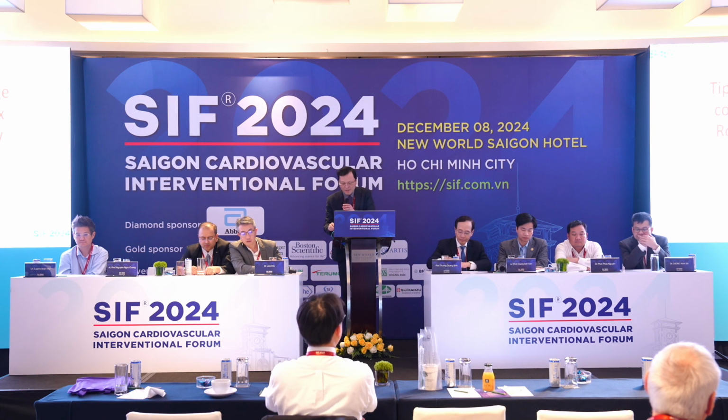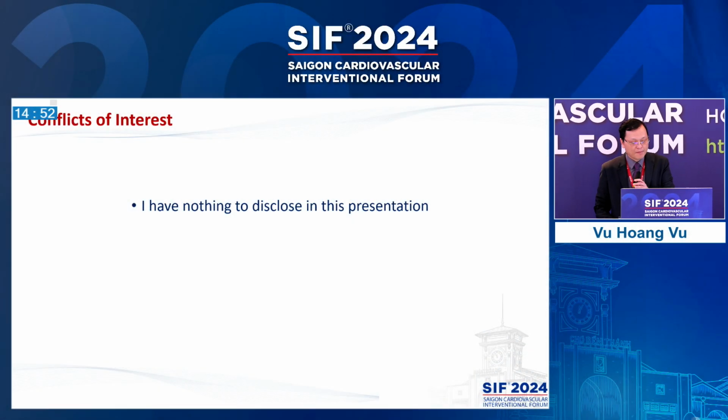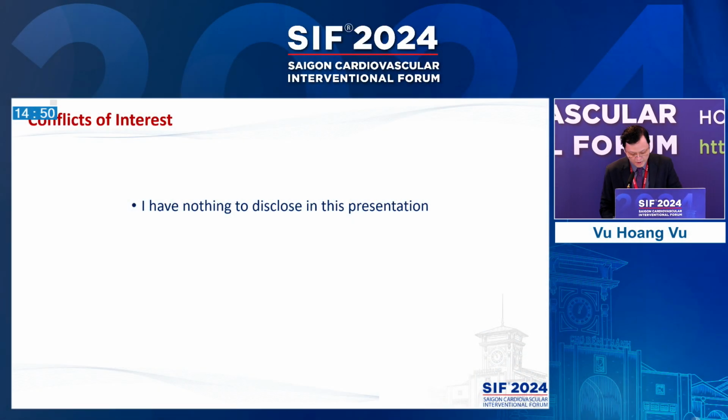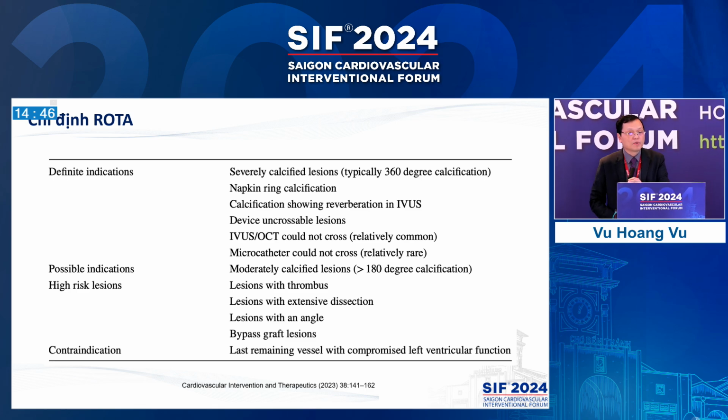So thank you, Chairman. I know that all of you from Hong Kong and all the colleagues here are experts on rotablation. So today I will just talk about some tips and tricks for rotablation atherectomy. First, the indication of rotablation. This is the definite indication and the possible indication in daily practice.